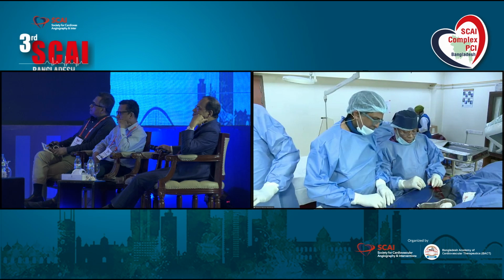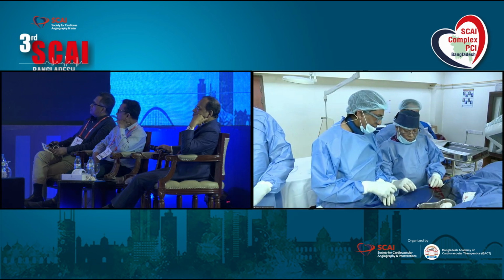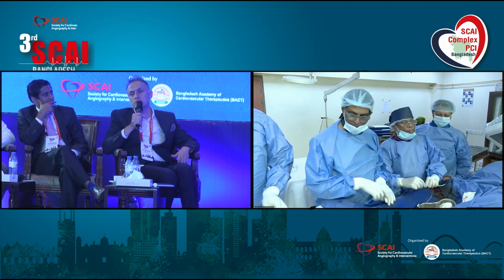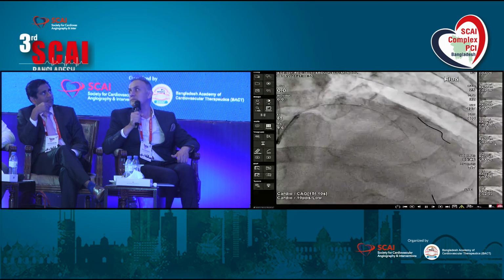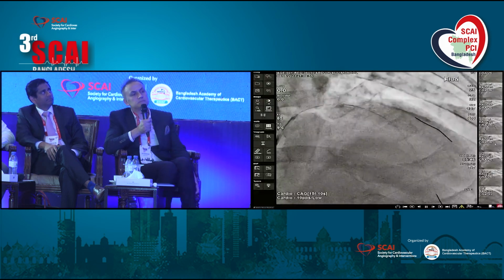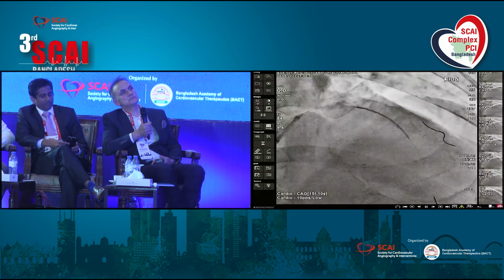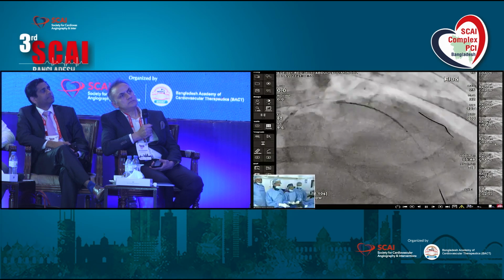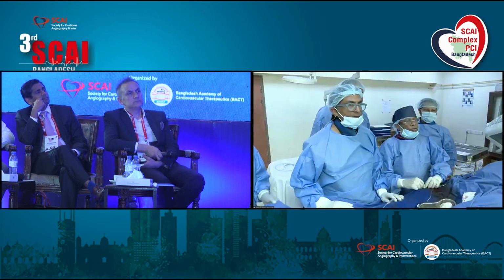So let's do a nice preparation of the lesion. If everything is good, with no dissection, we can try DCB definitely. And if not, we can do stenting, of course, and post-dilatation. And regarding the diagonal, yes, I would just keep it open with a wire. So, majority consensus is to keep the wire in the diagonal and treat the LAD. Yes, we have kept another floppy wire in the diagonal, and we have taken a Synergy 3 into 38. That's good.